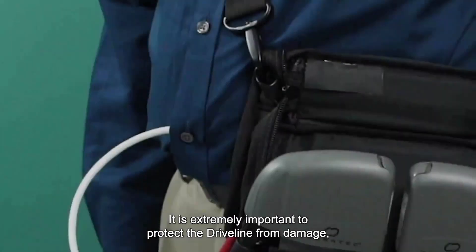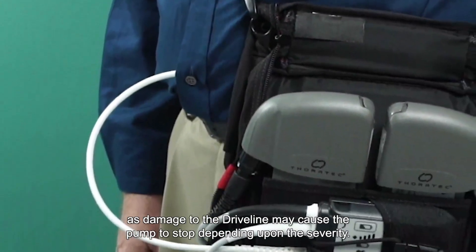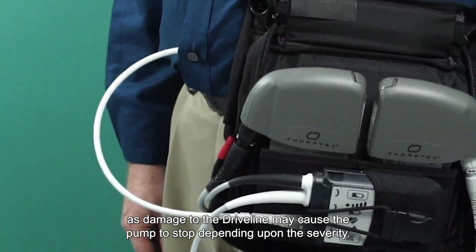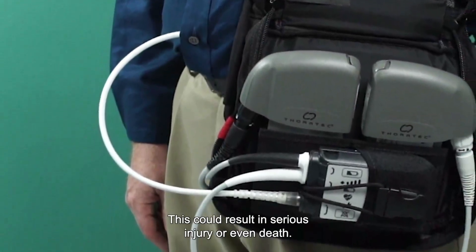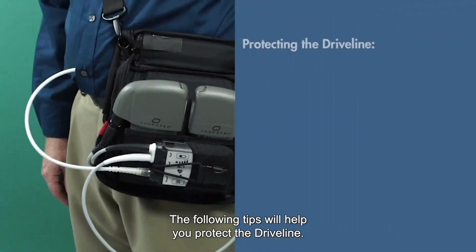It is extremely important to protect the driveline from damage, as damage to the driveline may cause the pump to stop, depending upon the severity. This could result in serious injury or even death. The following tips will help you protect the driveline.